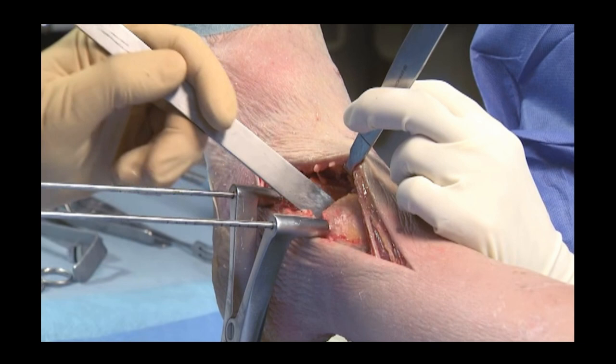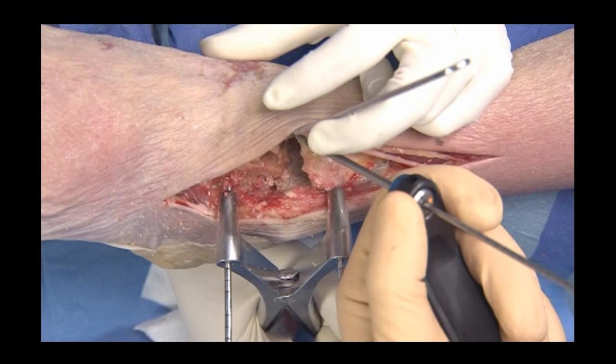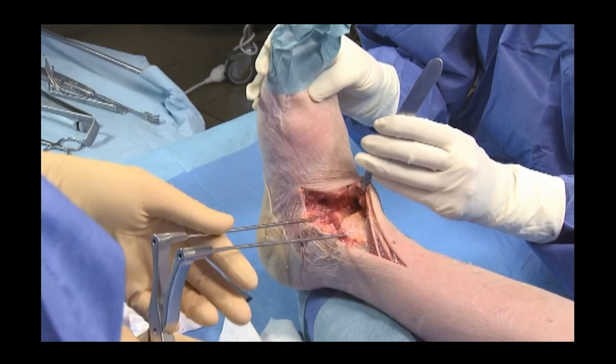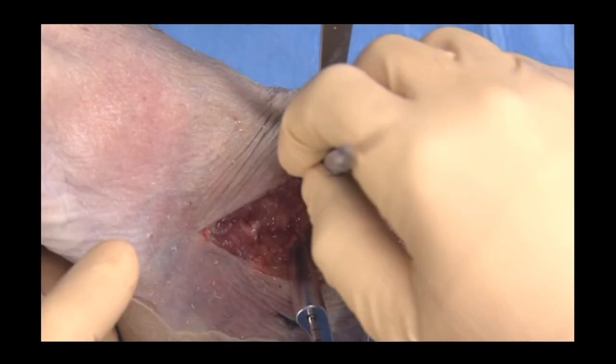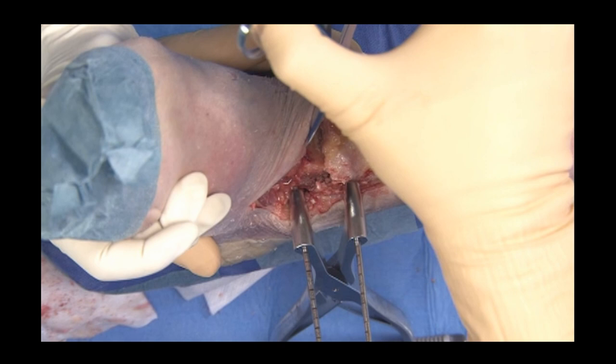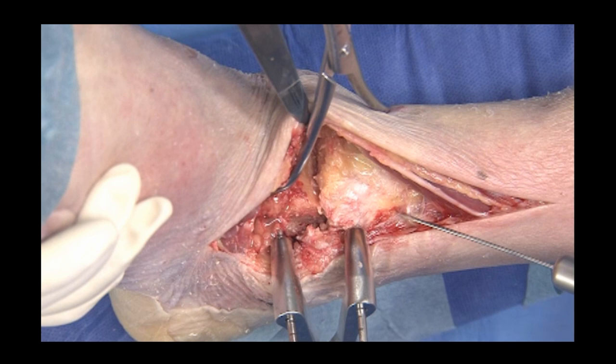The subchondral plates are drilled or scaled to achieve bleeding surfaces. The distractor is removed and replaced with a hinged compressor while positioning the foot perpendicular to the leg. Medial compression is obtained with large reduction forceps positioned on the talus neck and dorsal to the medial malleolus.